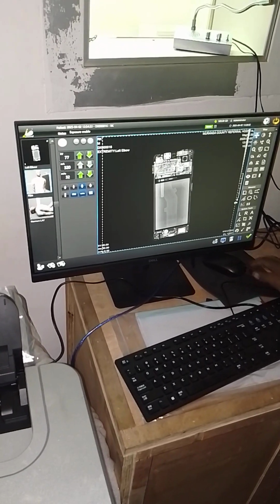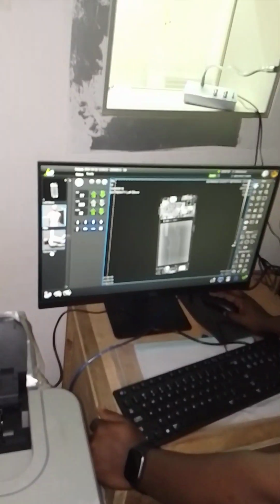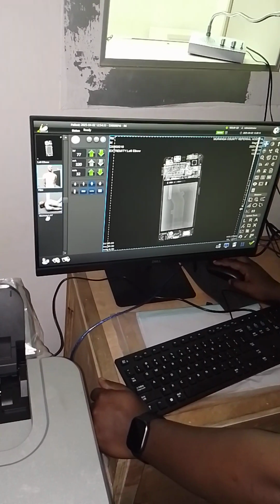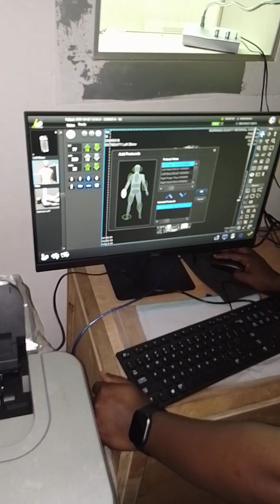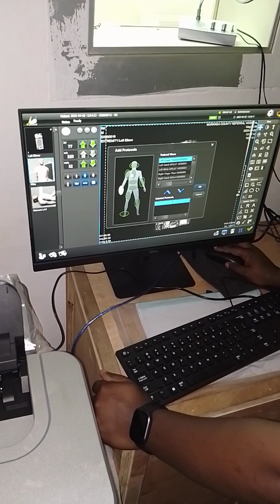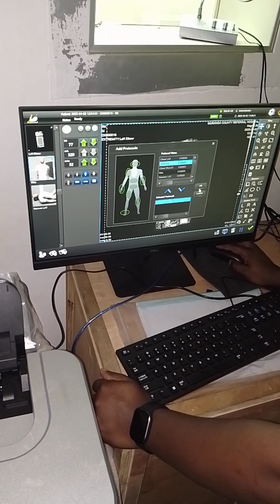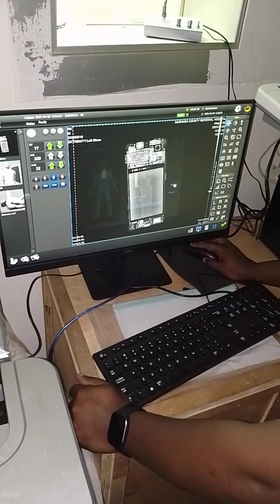Once you've selected the part, for this case, because the patient was already in the system, we were not able to select the part. But if we are doing a new patient, for example, you can select the organ, like the chest, lateral, posterior, anterior, and then you double click the part. Once it's here, you click OK. That part will come here, and we have that examination here.